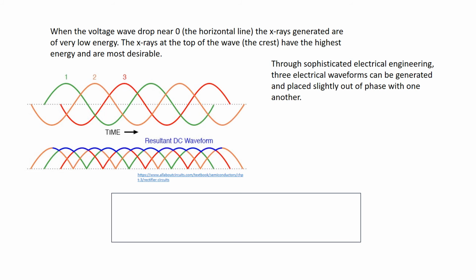So we've learned this when we learned KVP, that when you set up a kilovoltage peak, the peak value means that's the highest keV X-ray photons that can be in that technique, but there's actually very few of them. Well, now you can see diagrammatically why that is. Your KVP, your top peak values, are only at the tops of the waveform or at the crest.